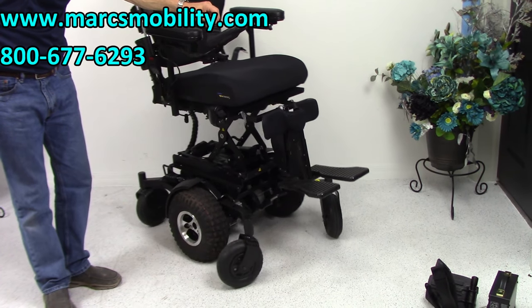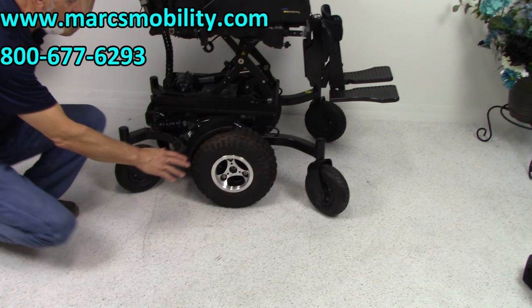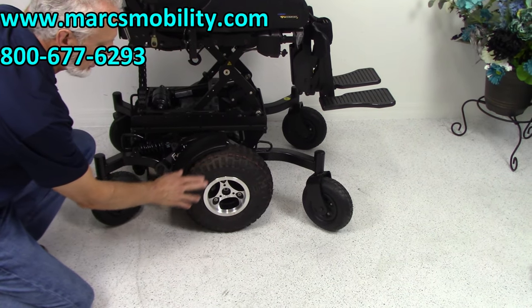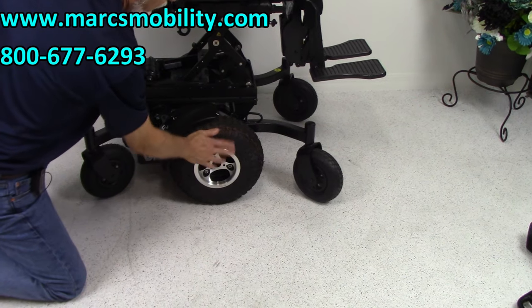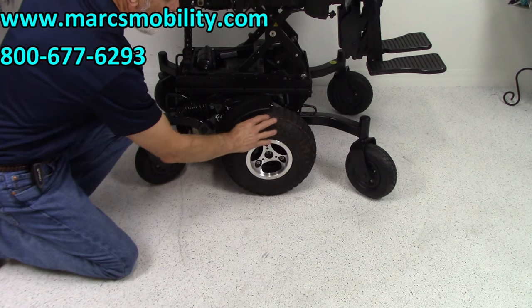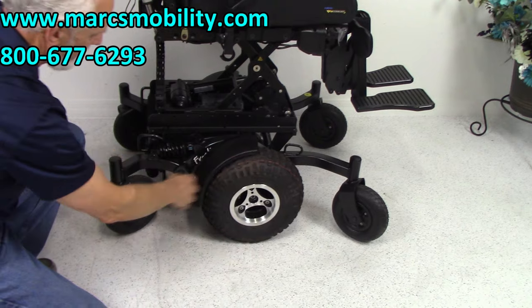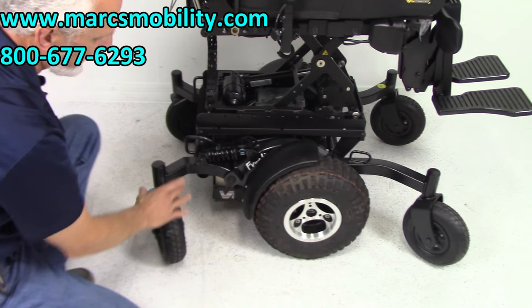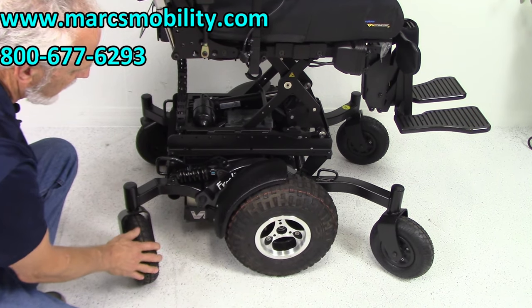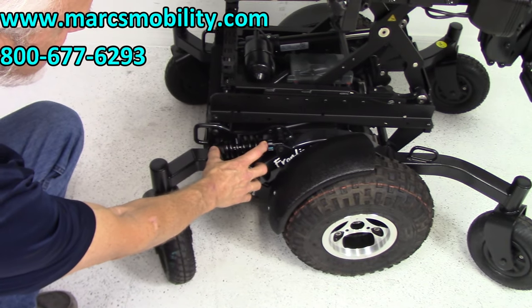Now while we have the seat elevated, let's look at the base. We've got 14-inch air tires — low-pressure, knobby tires with good traction, and the knobs are all brand new. You have large caster wheels in the back and double-fork caster wheels in the front, held by two forks on each side to hold the wheel in. We've got adjustable suspension here for the back of the chair.